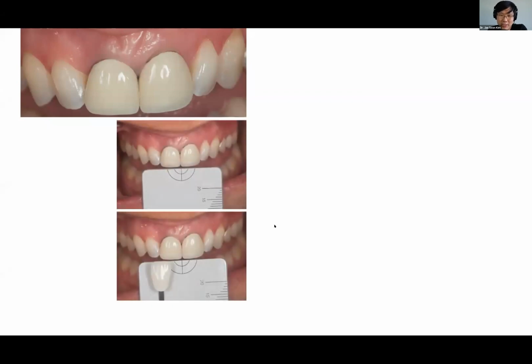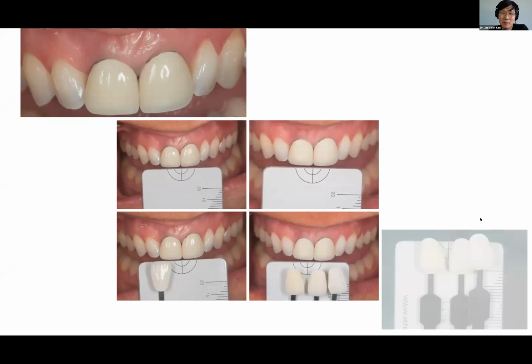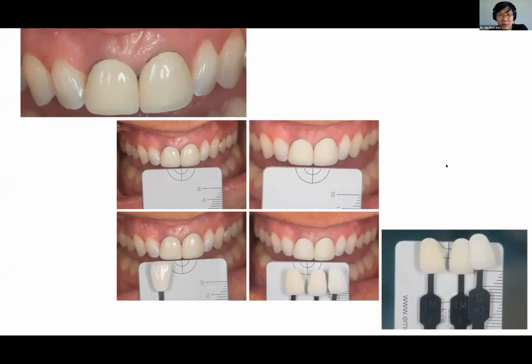And so I took all the photos that I need to do. Gray card. Okay, polarized filter. Okay, let's do this. And then don't forget this.